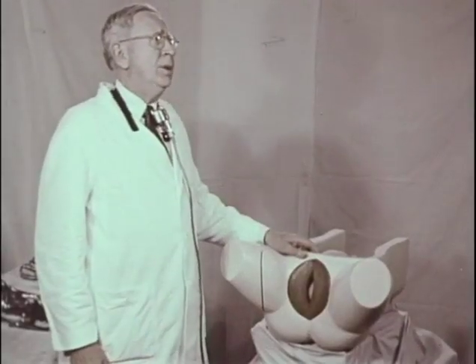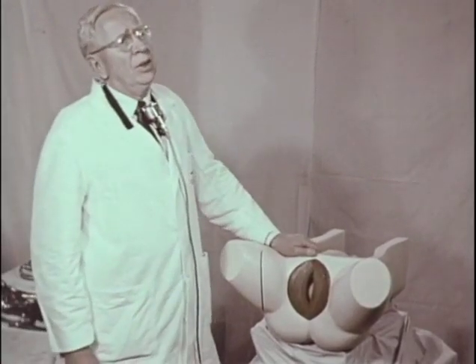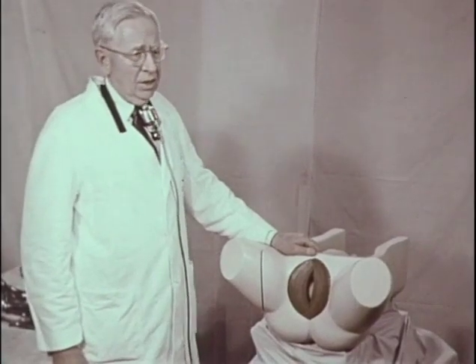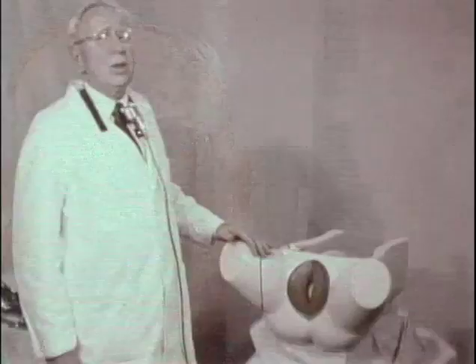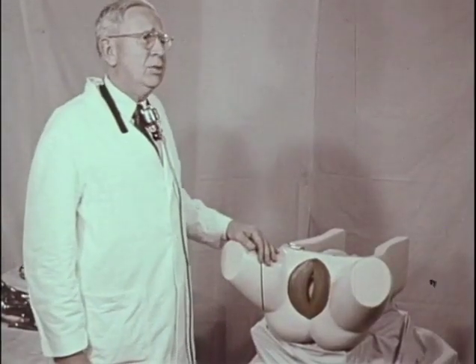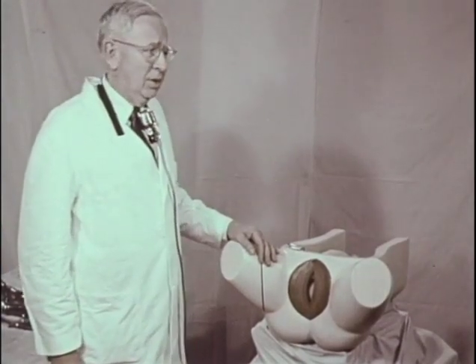These maneuvers may be classified as follows. The operative management, the forceps management of transverse arrest. First, we have manual rotation to anterior, followed by the use of the Simpson type of forceps because of the molding. And this is subdivided into the digital maneuver and the manual maneuver.